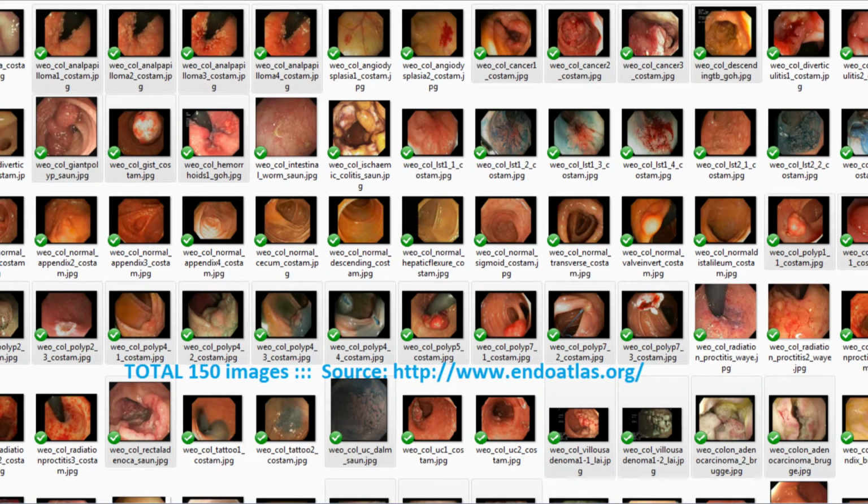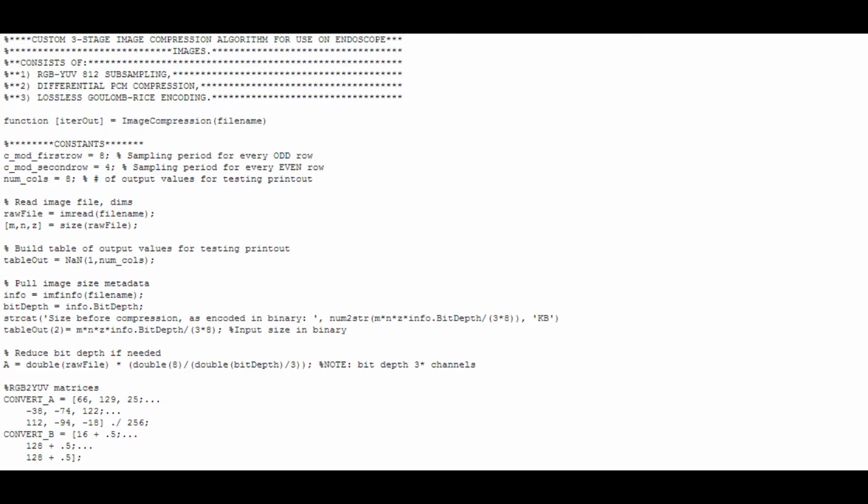In our MATLAB program, we implement Khan's algorithm with success. We tested the program on 150 corner-clipped endoscopic images from an online database and compared benchmark values favorably with those obtained by Khan. The program we wrote consists of a single file. To ease understanding of the code, we breakpointed key points in operation.